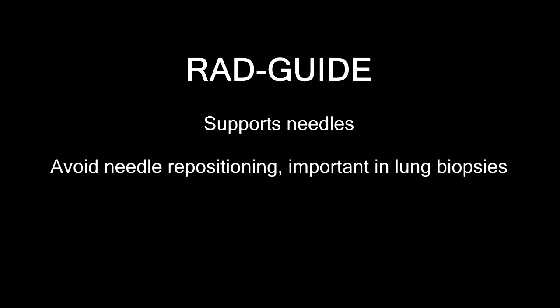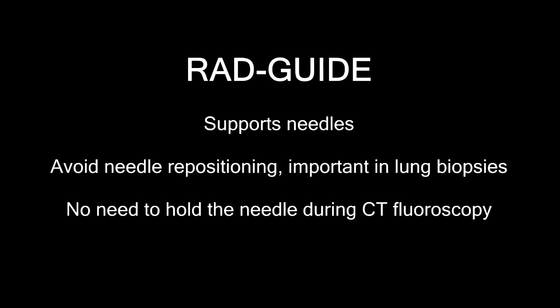So in conclusion, the RAD-GUIDE really supports well the needles. Most of the time you avoid needle repositioning, which is important in lung biopsies, and you will not need to hold the needle during CT fluoroscopy, reducing your radiation exposure.